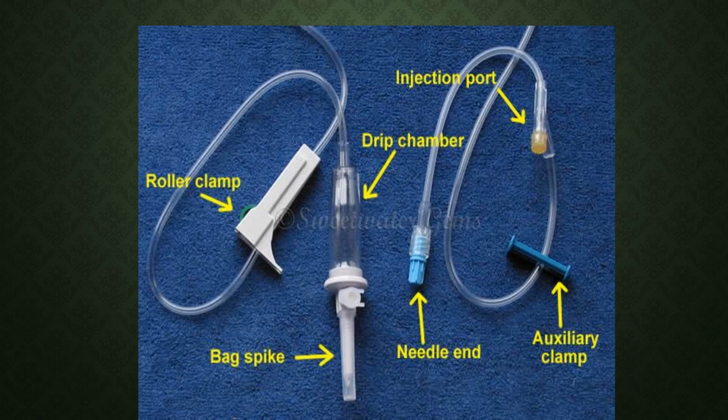If you just push the medicine straight in without pinching off back behind where you're giving the med, what'll happen is the medication will go backwards and you'll even get it up into the bag and it won't be IV pushed in. It'll just be running in as an infusion, and who knows how long it'll take to get in. So when you're doing an IV push medication, always pinch off behind where you're injecting, so the medication doesn't go up in the bag but goes into the patient.